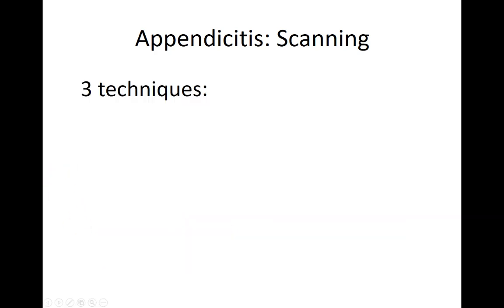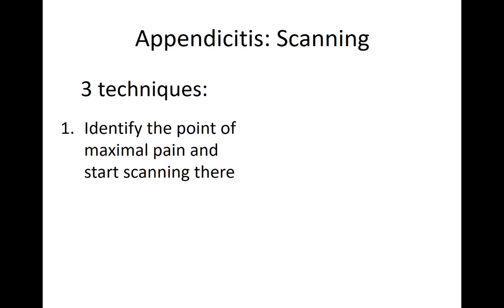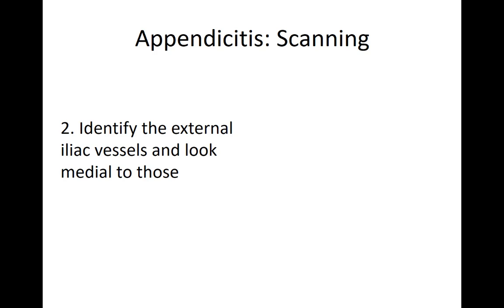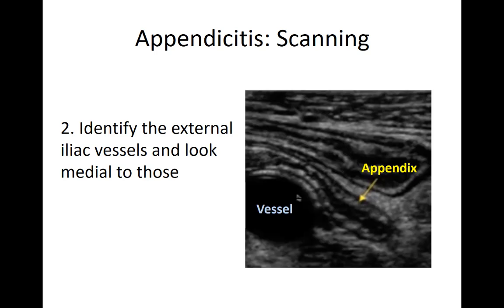There are three basic techniques for finding the appendix. The first and easiest is to start where it hurts — have the patient take their finger and point to the area of maximal tenderness and start there with the linear probe. The second technique, which is very helpful, is to identify the external iliac vessels and look around those. Here's the iliac vessel, and then this thing overlying it — that's the appendix.